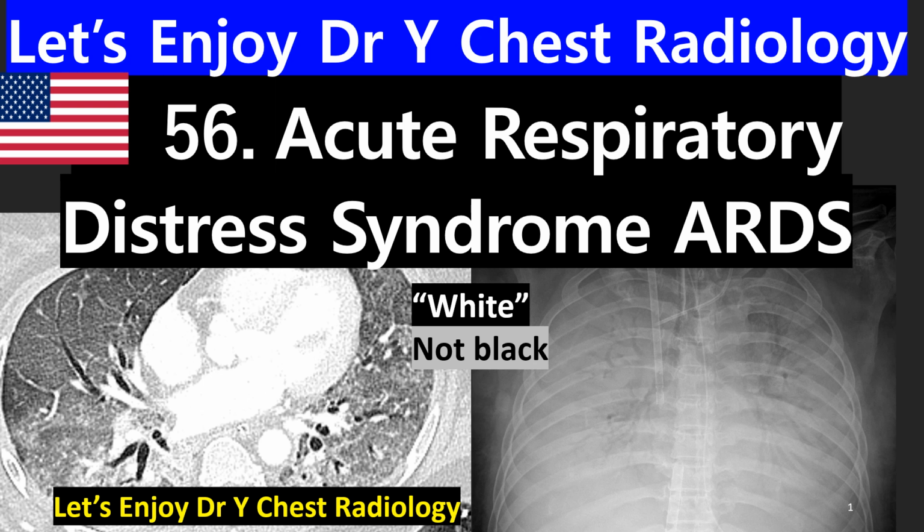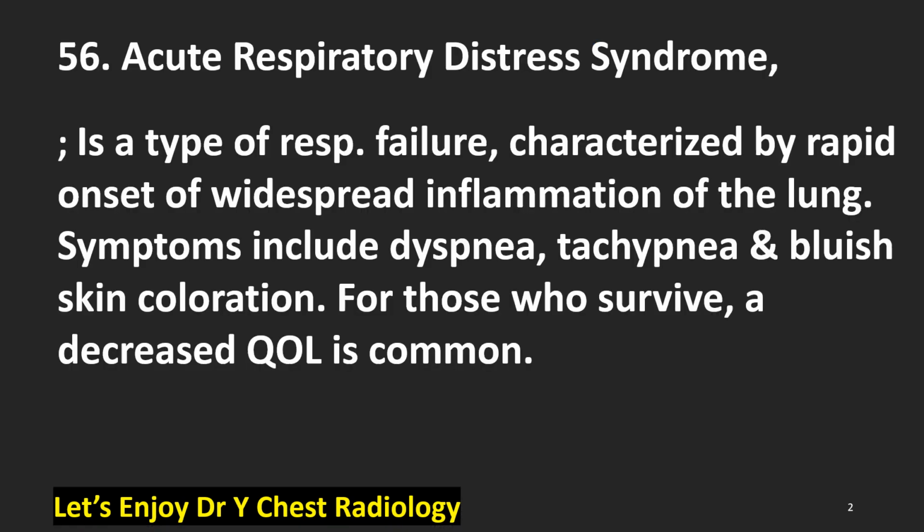Today, we're going to talk about acute respiratory distress syndrome, ARDS, chest radiologic and CT scan findings of ARDS. White, not black. Let's go. Before starting the museum tour of chest radiology of ARDS, we're going to review ARDS. ARDS is a type of respiratory failure.